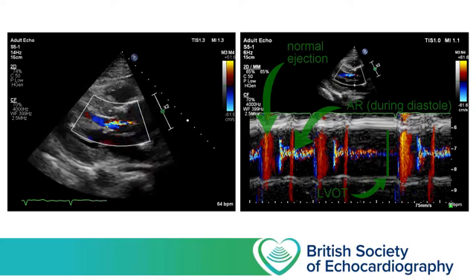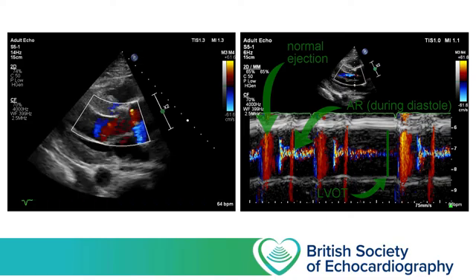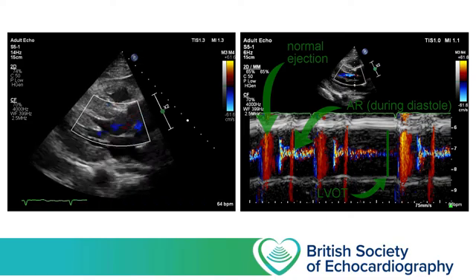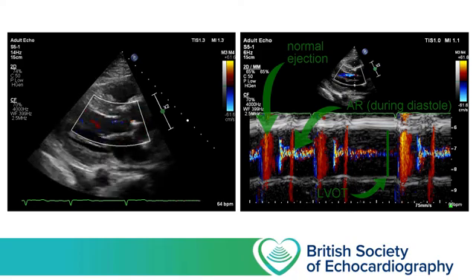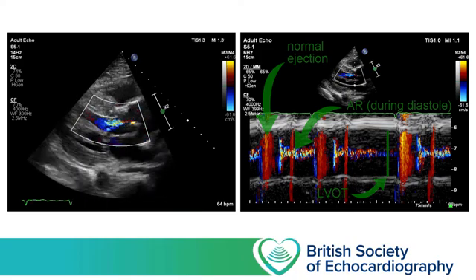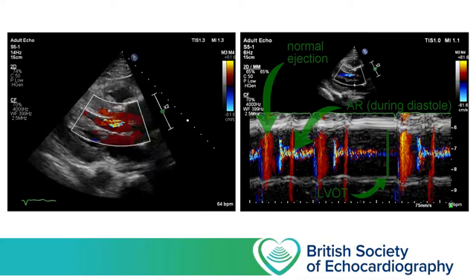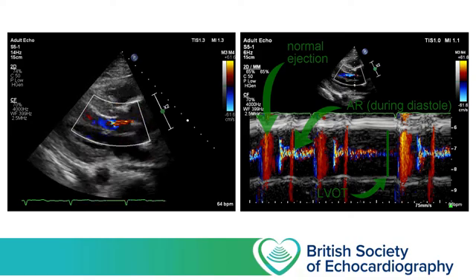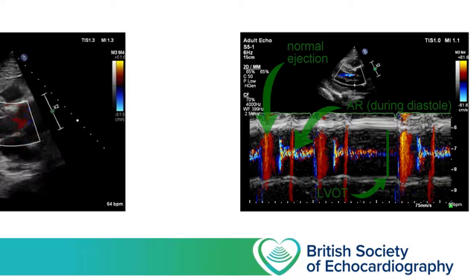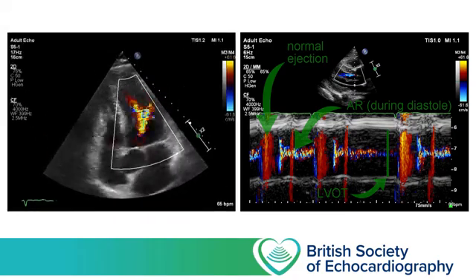Here we can clearly see systole and diastole, with relatively slow flow during systole and then a narrow jet of fast flow during diastole. You'll remember that when using colour, any malalignment between the flow of blood and the direction of the ultrasound beams will lead to an underestimate of velocity, and that's certainly happening during systole when the ejected blood is displaying laminar flow. However, the regurgitation inside the outflow tract is turbulent, with flow in all directions, including towards and away from the transducer. This, along with the relatively faster velocities of aortic regurgitation, means we're unlikely to miss significant AR due to malalignment.